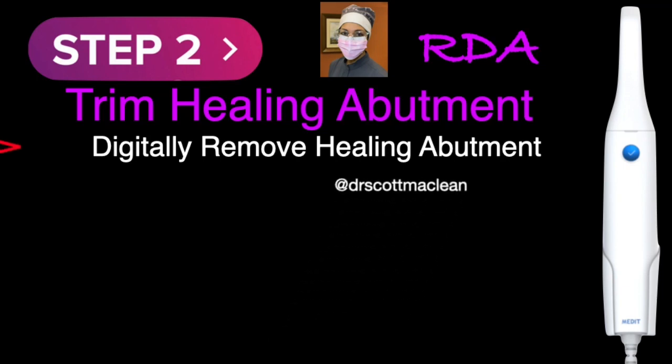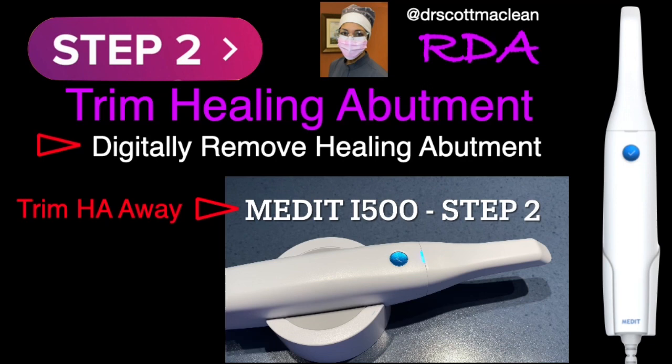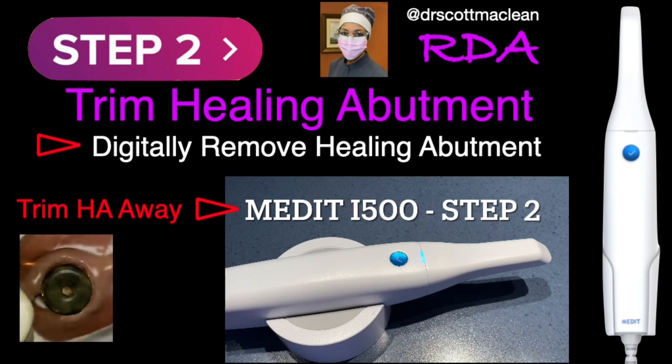Now step 2 is still done by the registered dental assistant. He or she will trim the healing abutment and make it so it's out of the way of the scan.